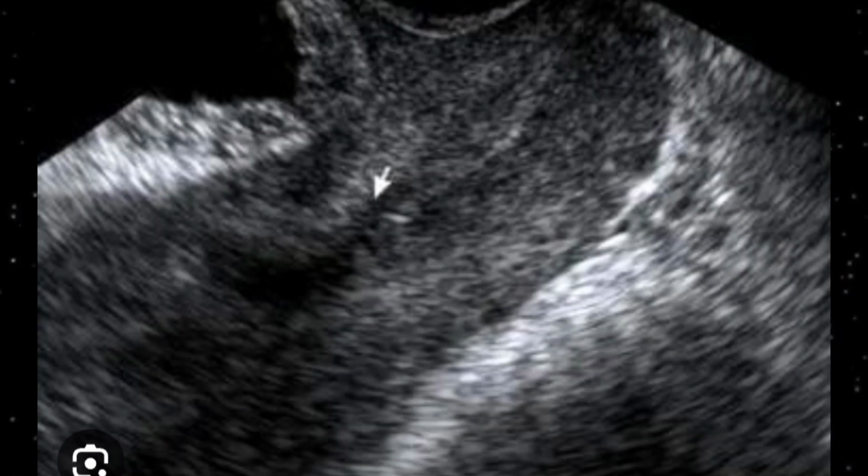This is another transvaginal scan, and on this scan another spectrum of cervical incompetence has been shown. Look at that white arrow indicating the internal os. The internal os is dilated, and beside this the upper part of the endocervical canal is also dilated.